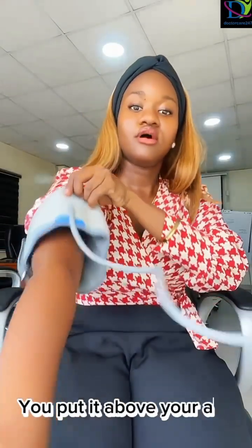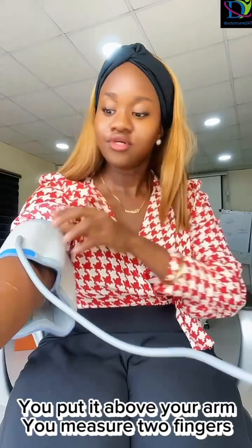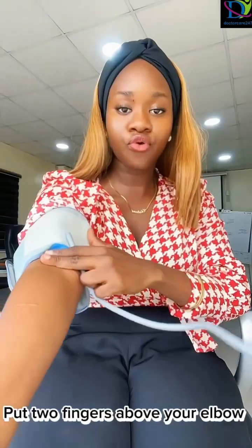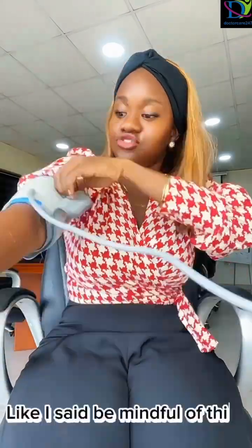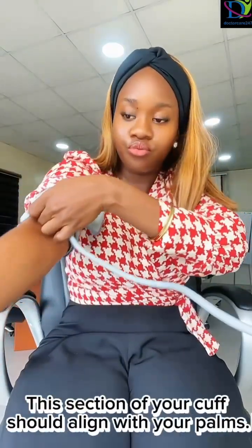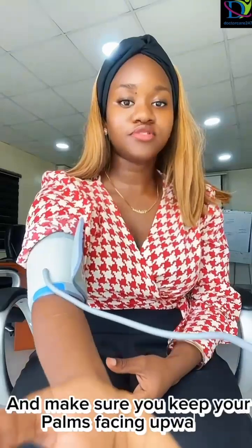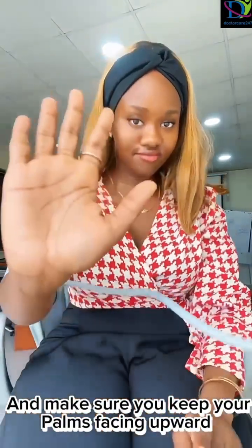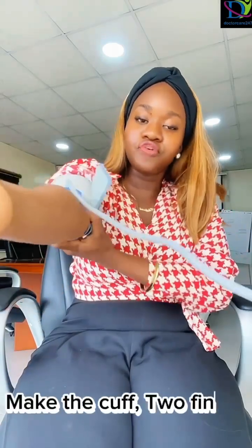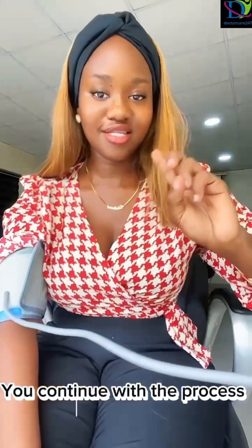You put it above your arm, measure 2 fingers, right? 2 finger rule. Put 2 fingers above your elbow, right? Part of your cuff should coincide with your palms, your middle finger, just like this, right? And make sure you keep your palms facing upwards, like this. Keep it facing upwards. Make the cuff 2 finger breadth above your elbow, just like this. Continue with the process. That's step 3.